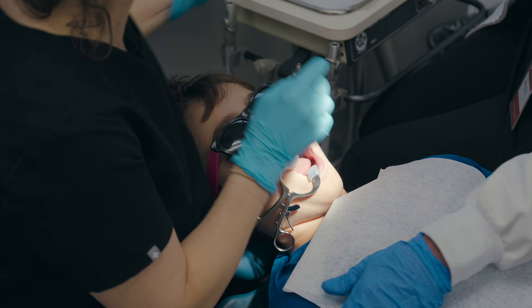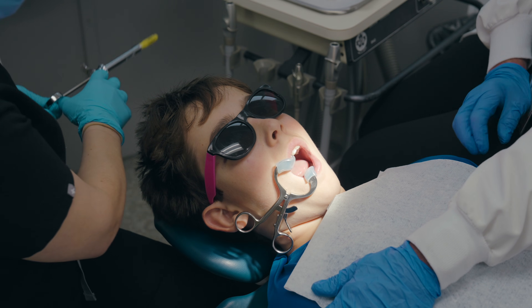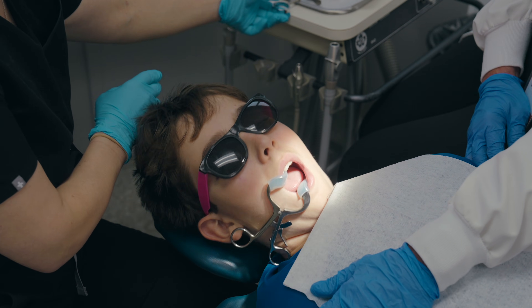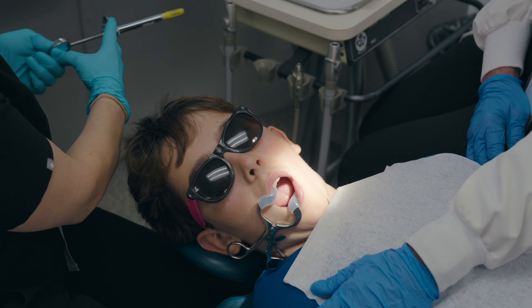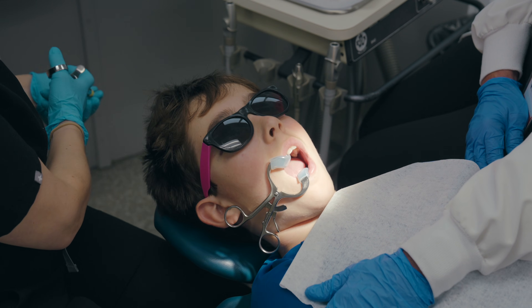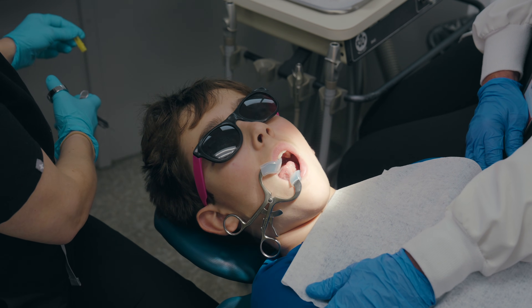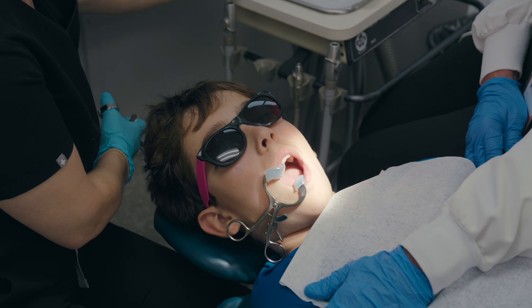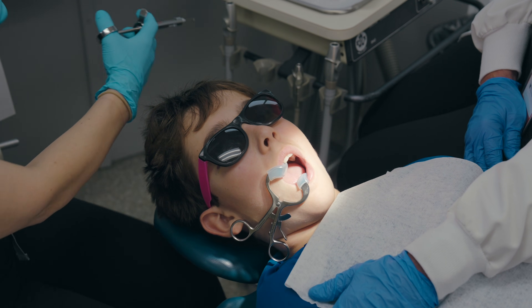Notice how the operator maintains head stabilization throughout all procedures by ensuring the patient's head remains between the operator's non-dominant arm and their body. The syringe is passed by the dental assistant to the operator behind the patient's head, out of sight of the patient.